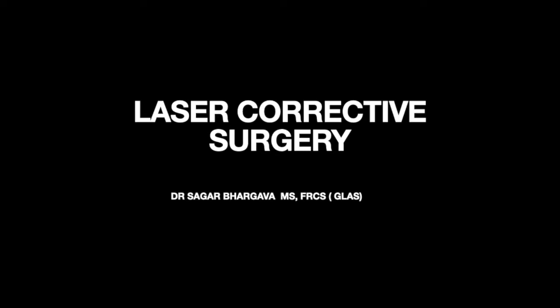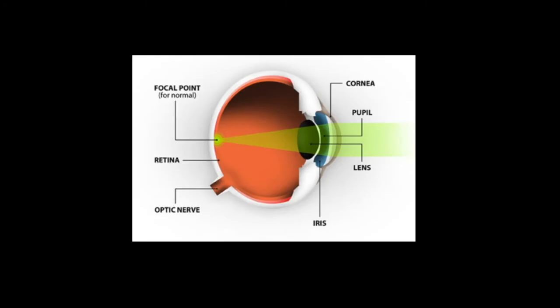This video gives information about laser corrective surgery, the types, the procedure, possible side effects, and complications. In order to understand this, let us go into the basics and understand how an image is formed in the eye. As you can see from the diagram, the light enters the eye from the cornea and through the lens.